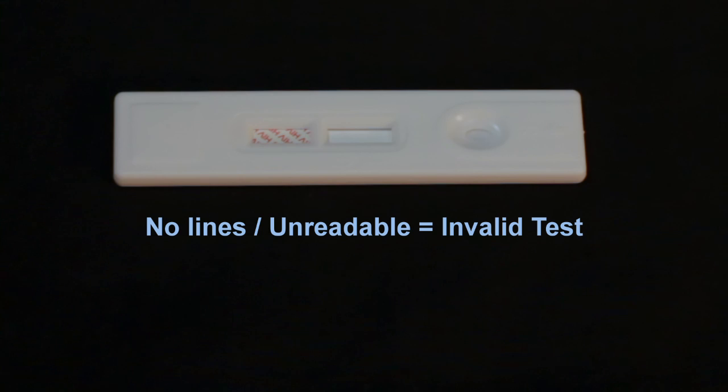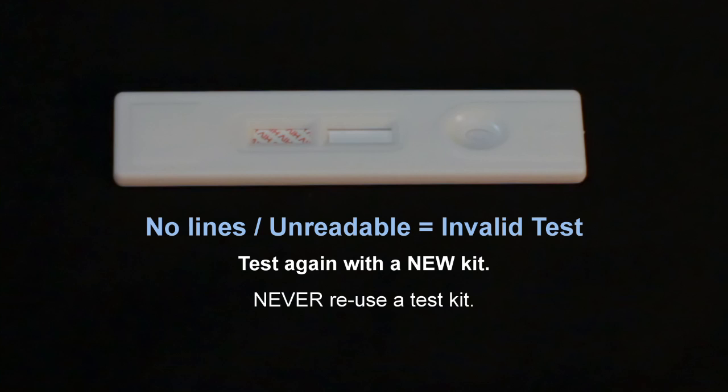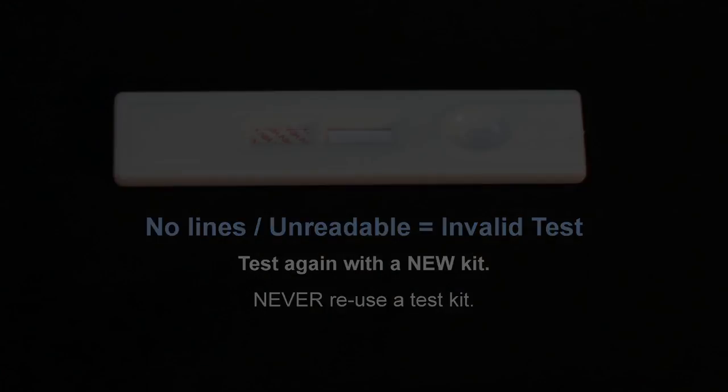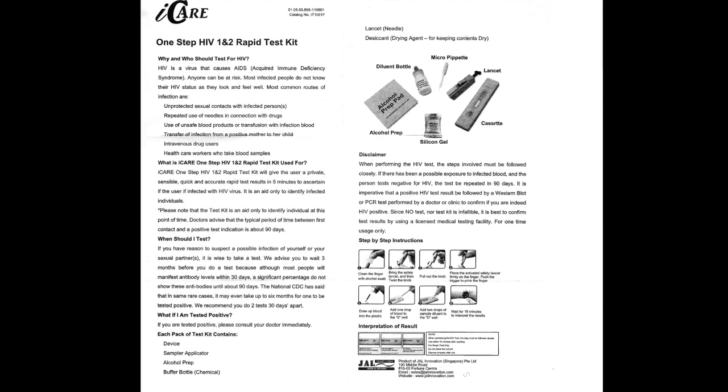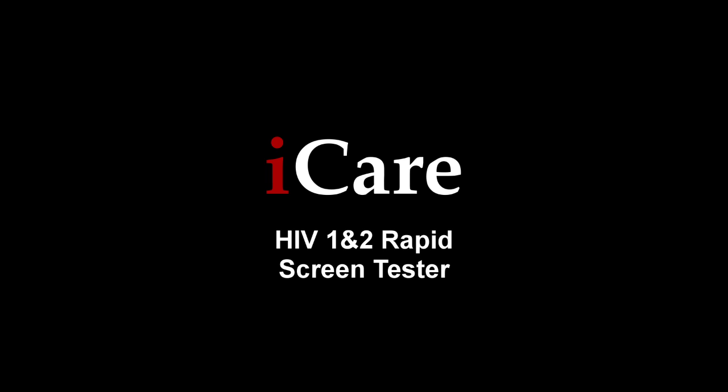If no lines appear or the result is difficult to read, the test is invalid. You should test again with a new kit. Never reuse a test kit. The included instruction sheet contains step-by-step directions as well as a guide for understanding results. Thank you for choosing the iCare HIV-1 and 2 Rapid Screen Tester.